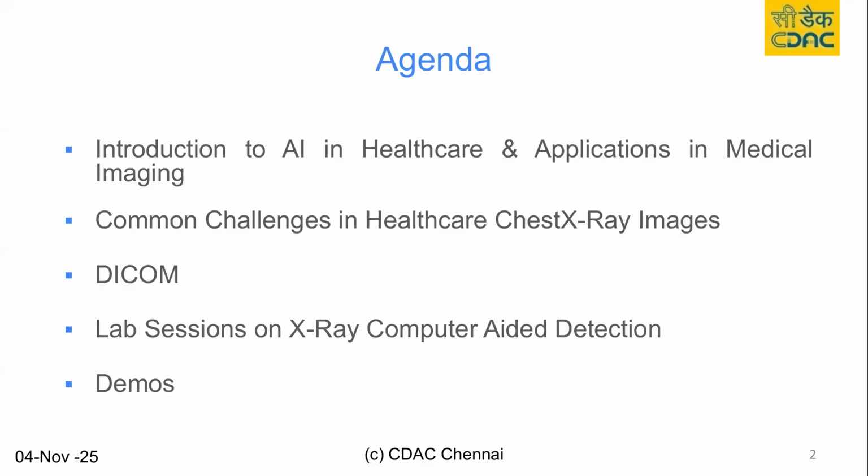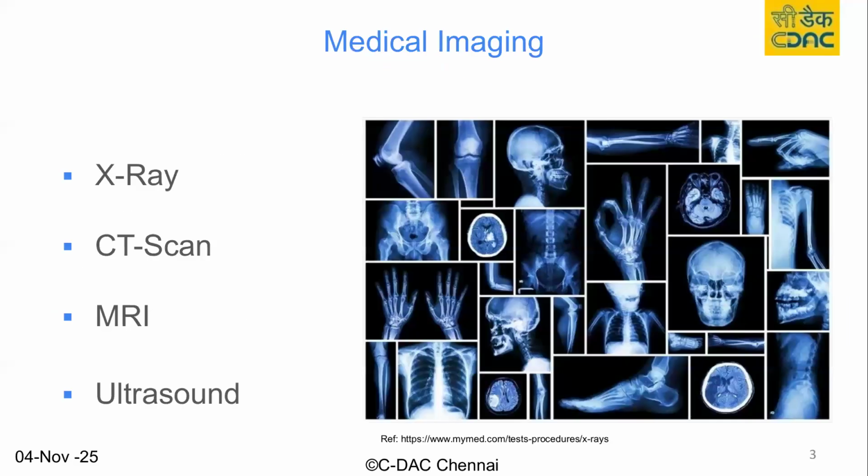So I will show you some Colab programs on how you can detect diseases on X-rays by using AI. Some demonstration can also be of the tool which we are working on. Also, if time permits, I will take you through. So to start with, what is medical imaging?